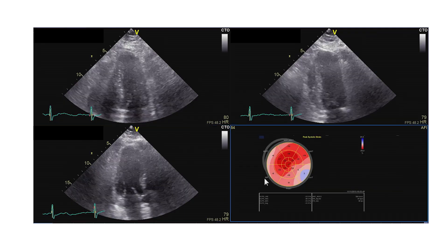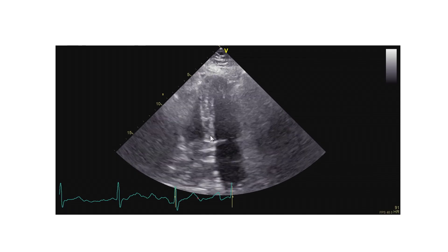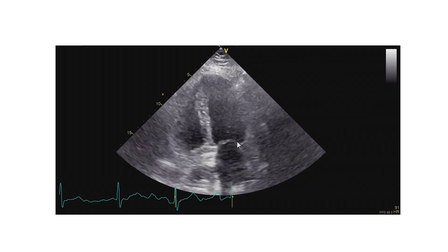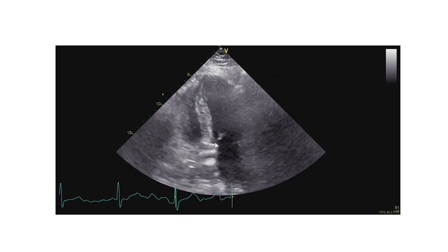But this is not the entire story. Let's perform a strain analysis in our patient. Did you expect such a poor strain? In reality, you probably could have, if you look at the longitudinal function on the 2D image. Let me go back to the 2D image — you will see that the level of the mitral plane is not moving at all. So if you have some degree of experience, you will already realize that this must be a problem related to longitudinal function of the ventricle.